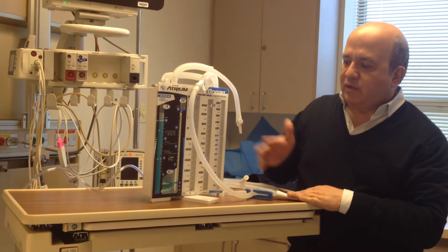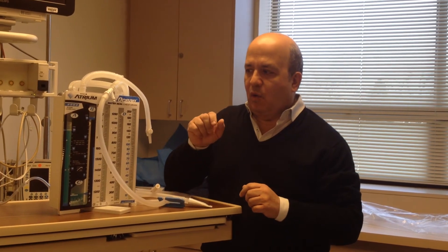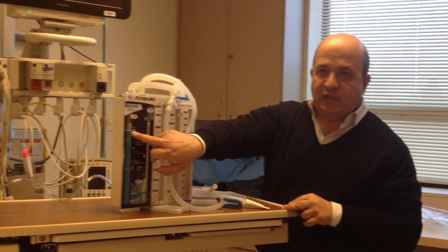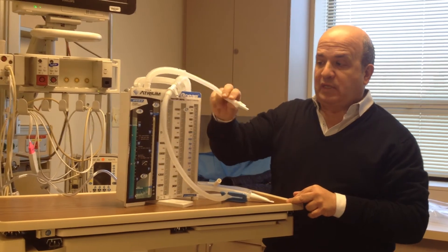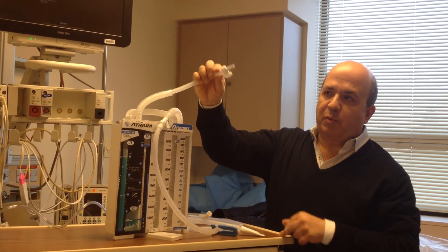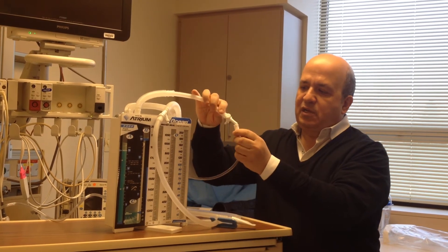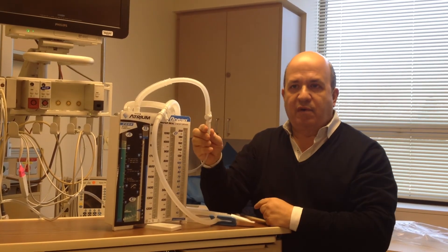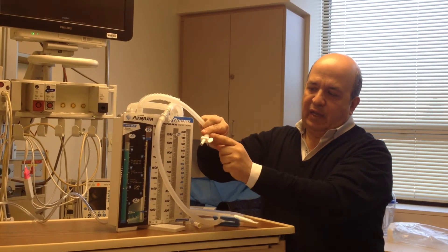The important things I'm trying to get across are that the levels have to be maintained. The suction doesn't have to be sky high. What 20 centimeters of water suction means is where this water level is — it has nothing to do with the amount of suction dialed in. And one of the more important things is that when it's water sealed, this has to be open with this valve straight so that this is open to air. If it's angled, it creates a closed system, which will cause a tension. Water seal means open, with this little valve in line with the tip.